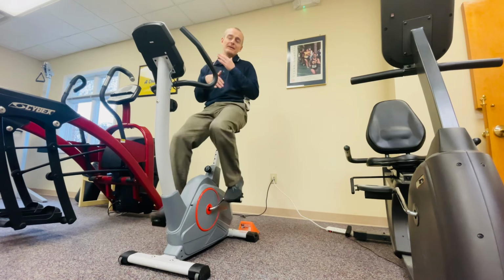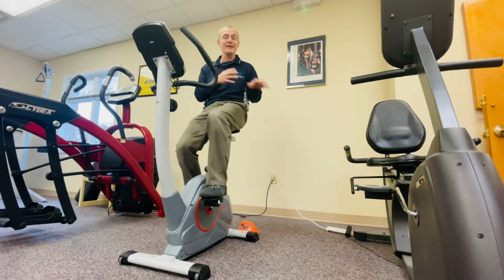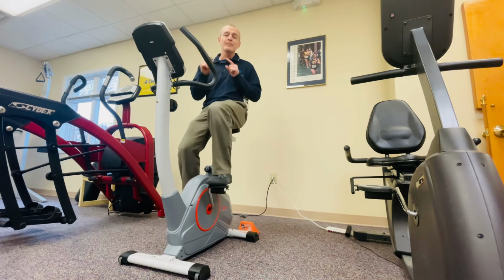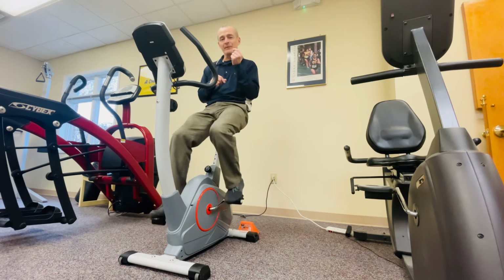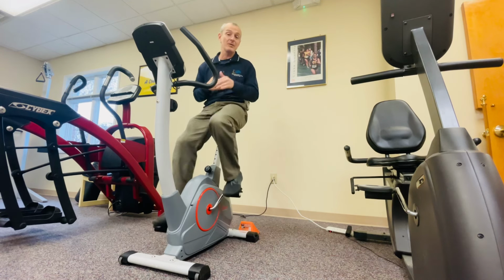easier to pedal the bike backward than they do forward when they're trying to gain range of motion. Now I've got another video that talks about why I believe it's easier to go backward, but what's great about this bike is there's an equivalent amount of resistance. It's a magnetic resistance going backward as there is going forward.